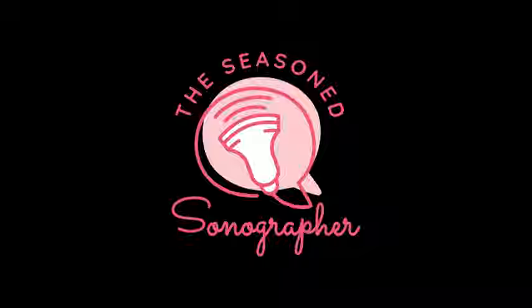The lateral ventricles are higher up in the fetal brain. You can see the atrium of the lateral ventricle, and it's filled with the choroid plexus. You want to measure, not including the choroid plexus, at the largest part, on the perpendicular axis of the lateral ventricle. This measurement is taken inner to inner and should be less than 1 centimeter. Greater than 1 centimeter would indicate ventriculomegaly and possibly associated with other anomalies, but definitely warrants further evaluation.